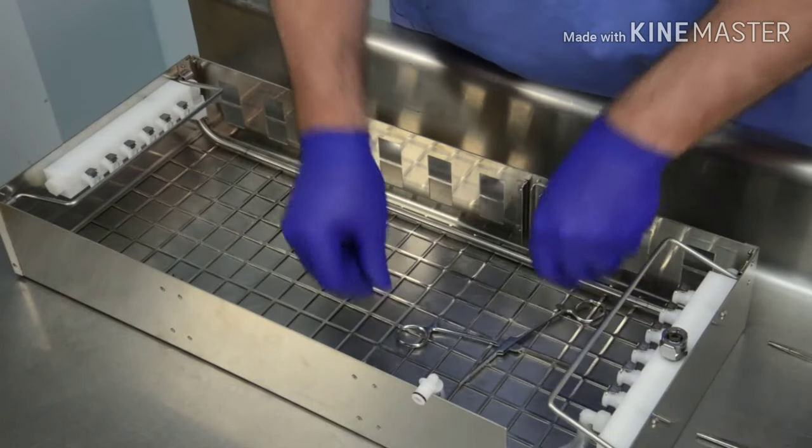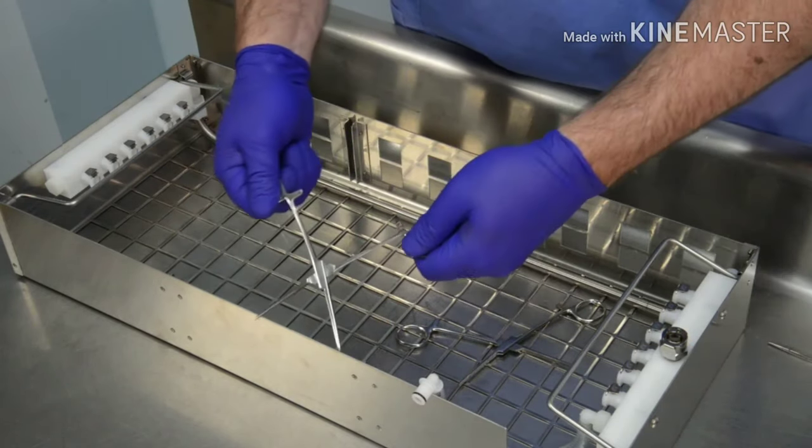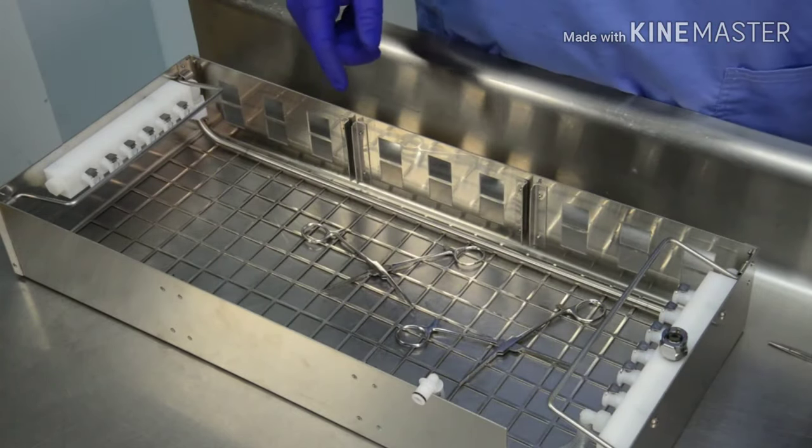Always load non-lumen instruments first. Arrange these instruments flat on the bottom of the basket, making sure they do not touch each other. For hinged instruments such as scissors and retractors, open fully for thorough cleaning.